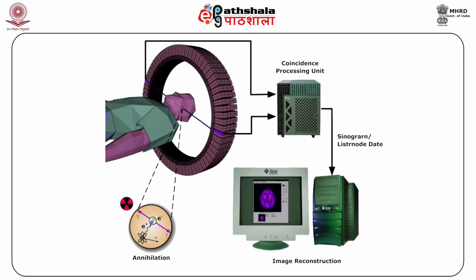The radiotracer follows the path of glucose and decays at a known rate, emitting a positron that collides with an electron in surrounding tissue and generates two photons, gamma rays, that travel in opposite directions out of the patient's body. Detectors positioned around the patient pick up the intensity and source of the gamma rays. More highly activated neurons need more glucose, so the FDG theoretically reveals which areas are more active than the others.